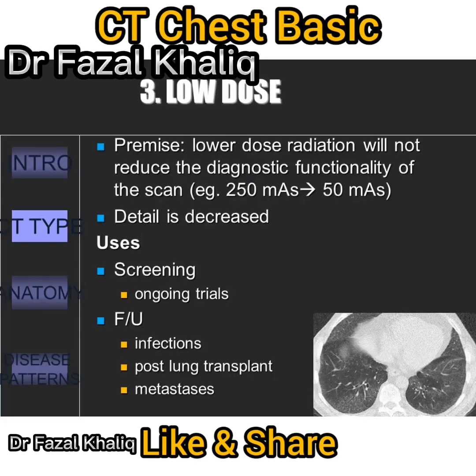We are increasingly using chest CTs. This has the potential to increase the radiation burden to the general population. It is important that we reduce this. Conventional chest CT is usually performed using settings between 220 and 280 milliamps. Low-dose CT would bring this dose to about 50 milliamps.